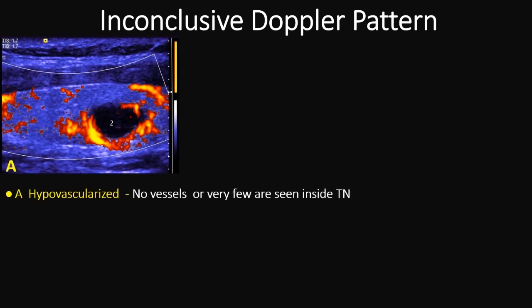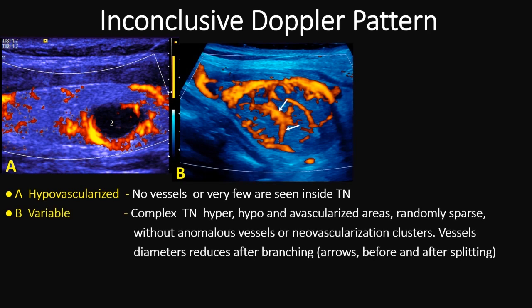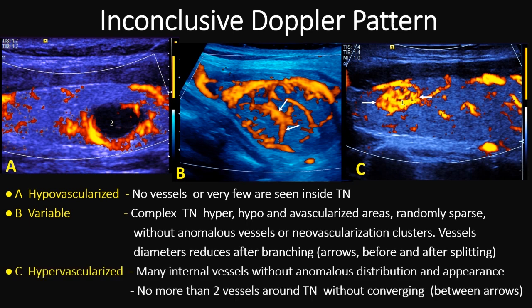We also have three inconclusive Doppler patterns to show. The hypovascularized inconclusive pattern shows no vessels inside the thyroid nodule. The variable inconclusive pattern shows a complex thyroid nodule with hyper-, hypo-, and avascularized areas, randomly sparse, without anomalous vessels or neovascularization clusters, and vessel diameters do not reduce after branching, as shown here. The third example is the hypervascularized inconclusive pattern, with many vessels inside but homogeneously dispersed with normal appearance, and only two vessels around the lesion.